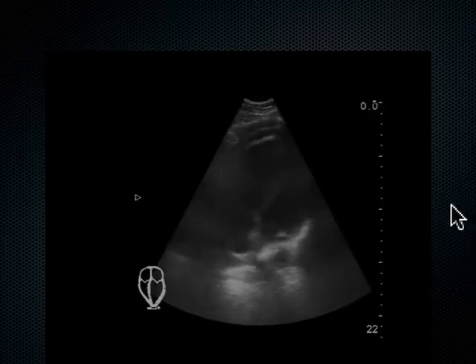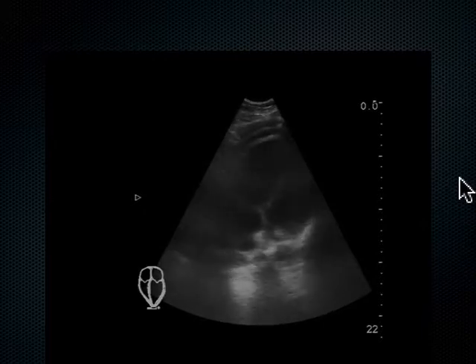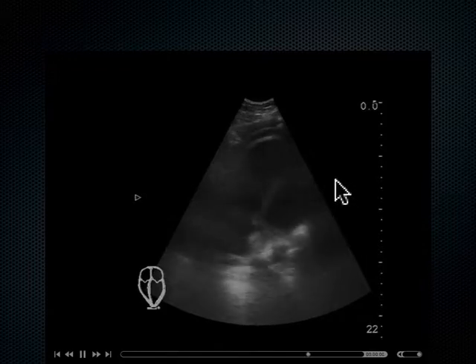Now, about 30% of the time, you don't feel a carotid pulse, but you actually see this amount of cardiac activity. So this is called PCM, pulseless cardiac motion. It tells me the patient's still alive, okay? I don't know why they're not having a carotid pulse. It's not enough blood pressure to make a carotid pulse, but about 30% of the time, you will see organized cardiac activity like this, yet no carotid pulse. I shouldn't say good cardiac activity. This is very weak cardiac activity.